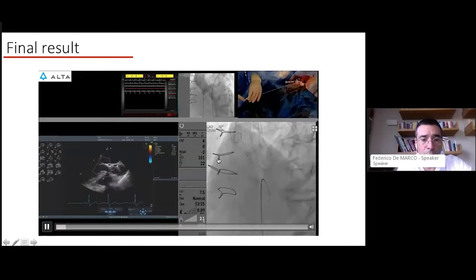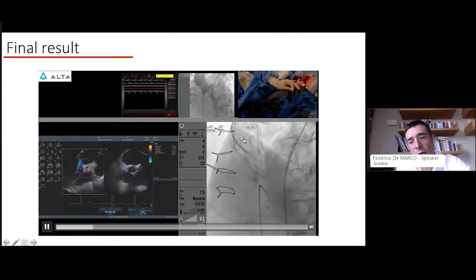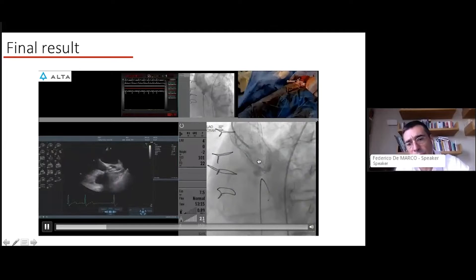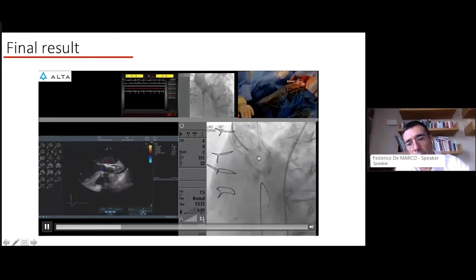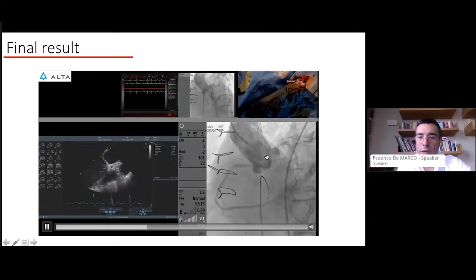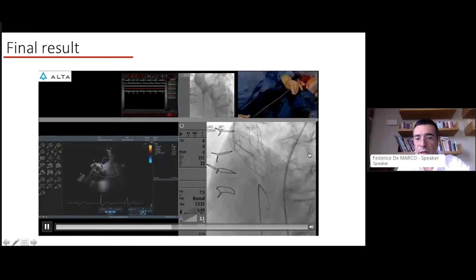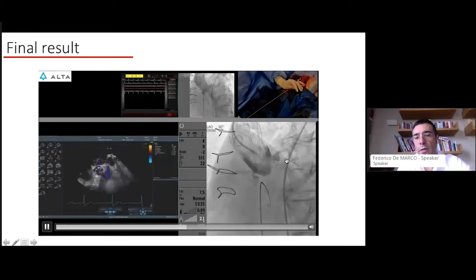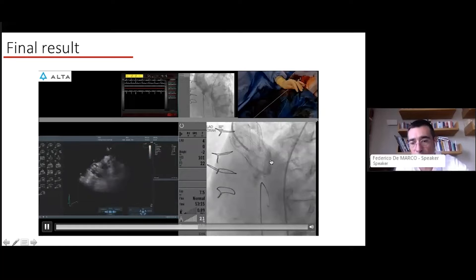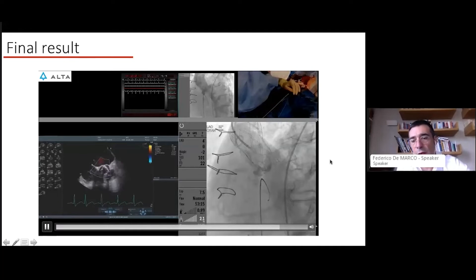This accelerated video is interesting because it shows what we did after the procedure: we advanced a guide wire into the left main and were able to selectively engage through the wide cells of the Portico device. This demonstrated that the valve could be accessed through the Portico struts, confirming no coronary occlusion — a very nice result with no aortic regurgitation and perfect access to the left main and left coronary system.